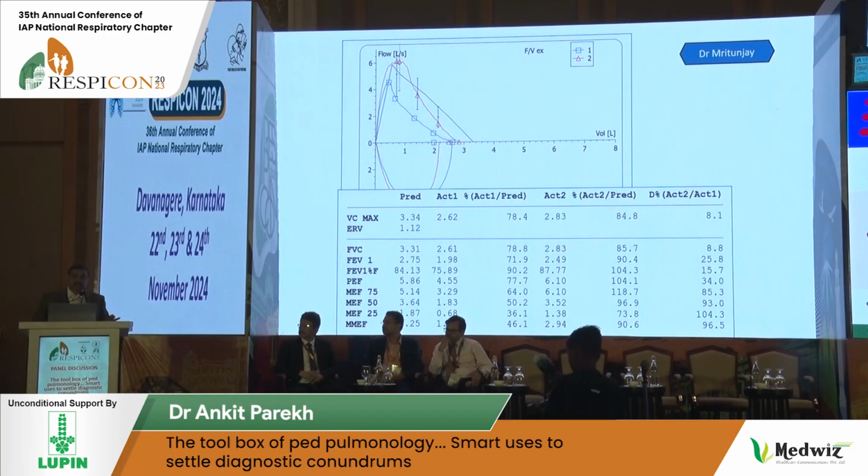There are groups of patients where you're going to underestimate their symptoms, especially in adolescents, especially in children who have had asthma for a long time. They sometimes tend to tolerate their symptoms, and they don't realize that they are actually having exercise-induced symptoms, right? And the child is only on budesonide. So a 12-year-old child, with this spirometry, I'll add a LABA in that case. Agreed. I totally agree with that.